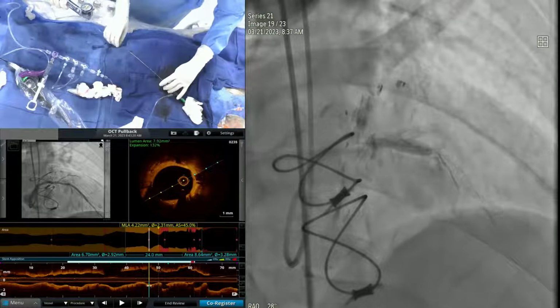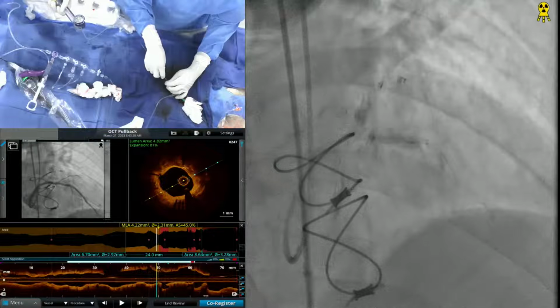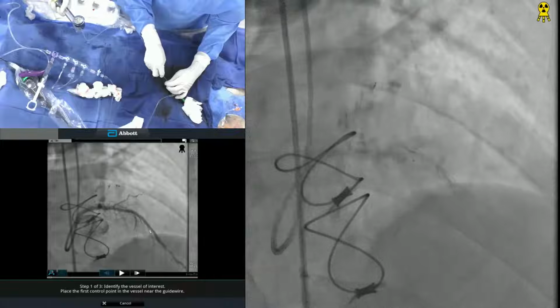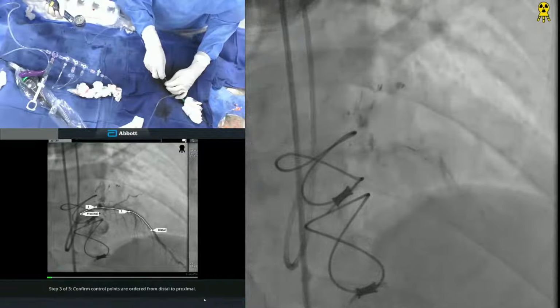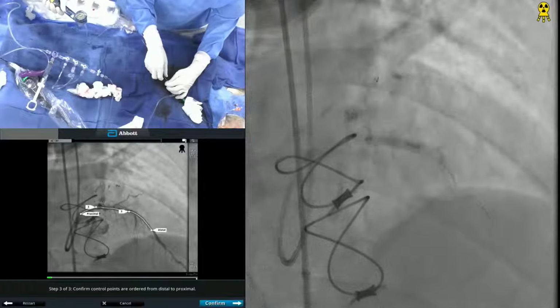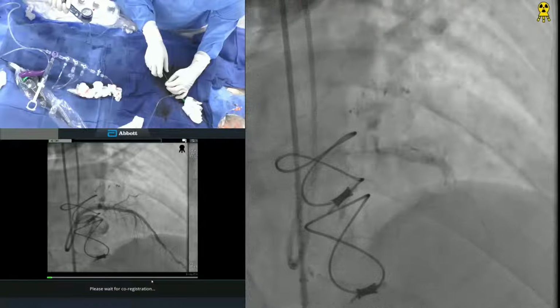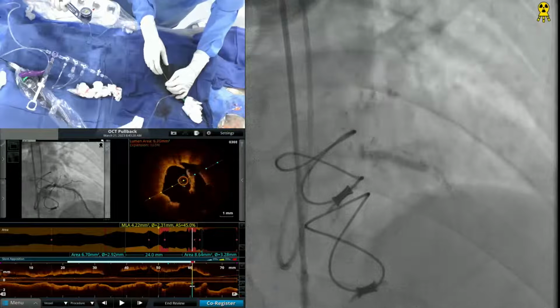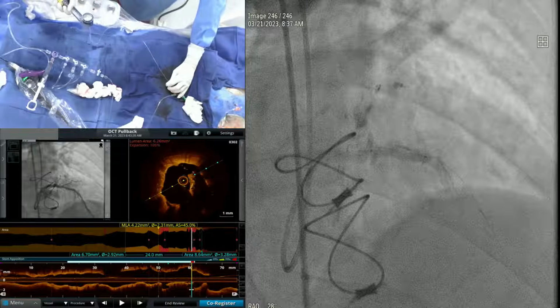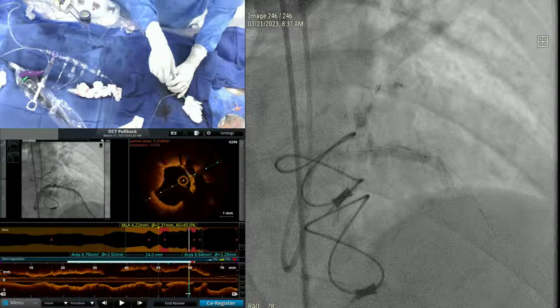Is this post dilatation or are you going with a 3.5 20 stent? It's a 3.5 20 post dilatation balloon. Okay, perfect. So then we'll take a 3.5 28 because we used a Promus on the other side. We try to use the same. Okay, nice case. Underneath, a little spicule is still there. See that? Yep. But we have to dilate there now.